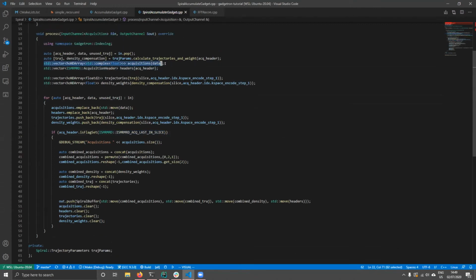But we don't want a standard vector of hoNDArrays. That's like a list of matrices. So we call concat, which essentially concatenates all the individual acquisitions along a new dimension. The acquisitions are stored as k-space points and then channels, and now we added a new dimension, which was the individual acquisitions. We would like the channels to be last, so we permute in order to move the channels to the last dimension. And we reshape because we want to combine the first two dimensions. So now we have one array containing all the spiral k-space along the first dimension, and then the individual coils along the second one.